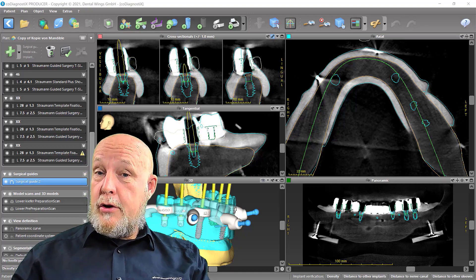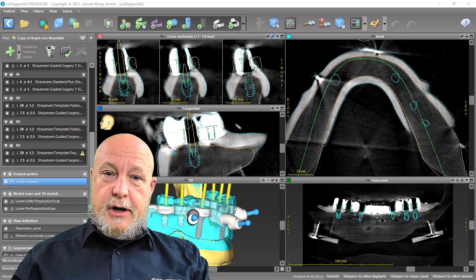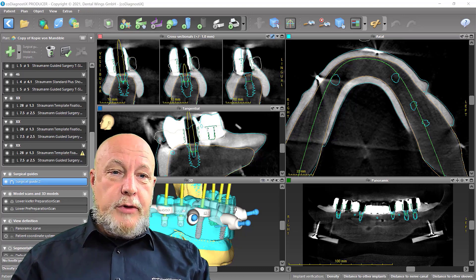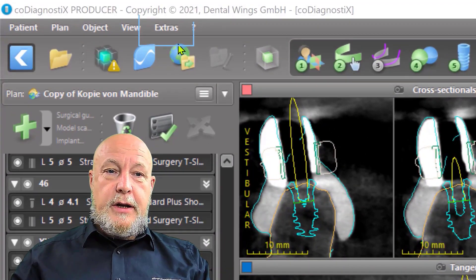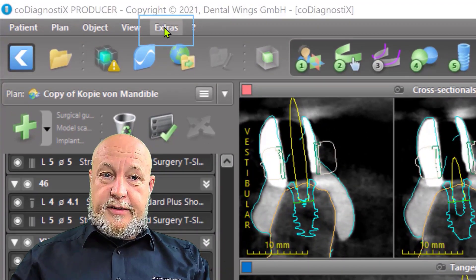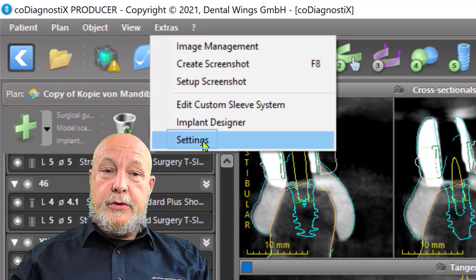How to do it? Have a look — you can go to Extras, then to Settings.